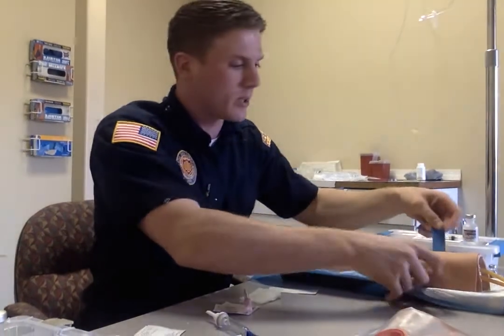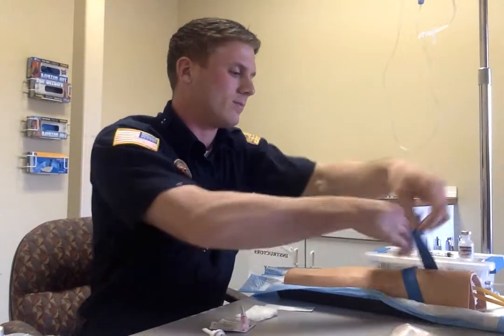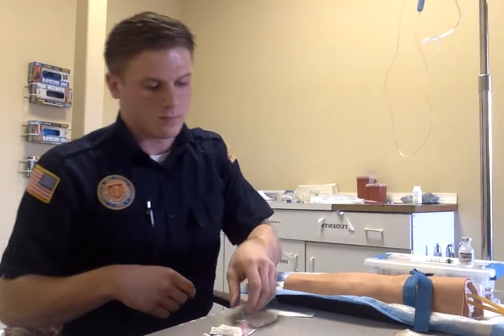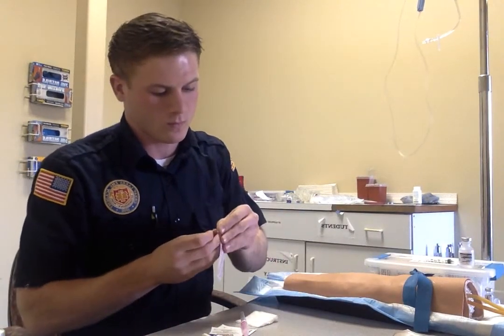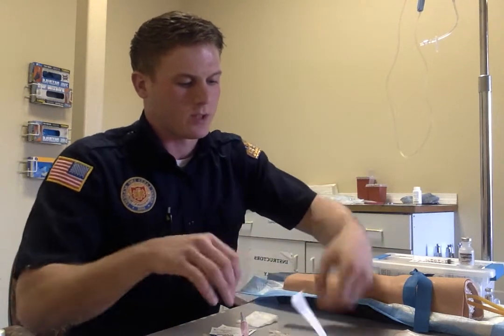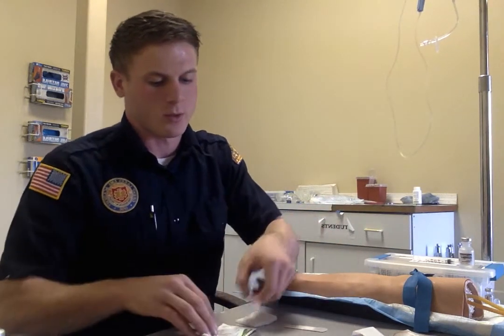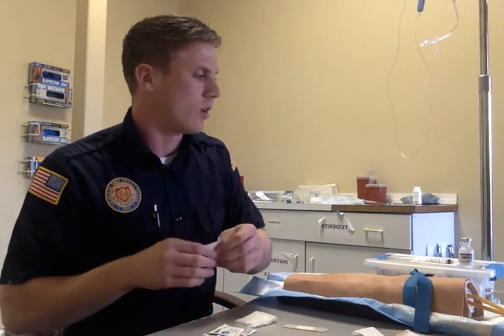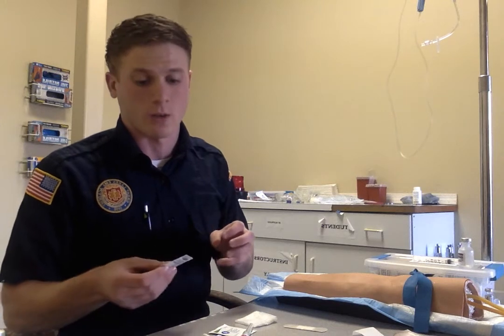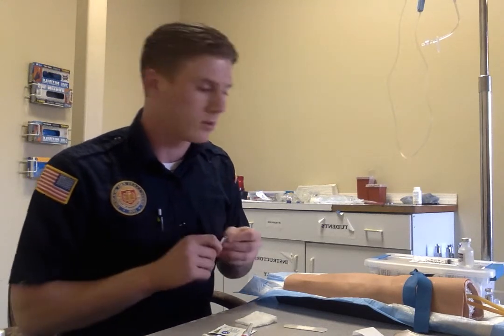We can start our IV on our patient. For this amiodarone drip we will be putting 150 mg of amiodarone into this 250 bag and then running it wide open. So we'll do the IV.